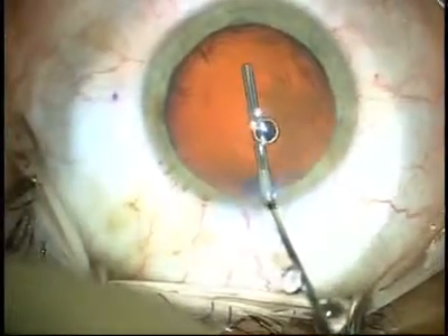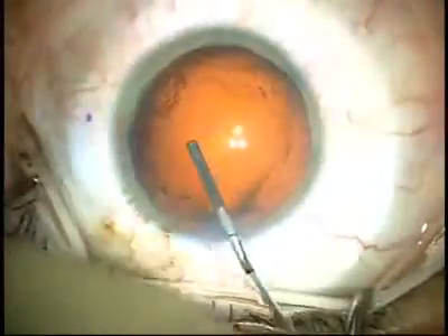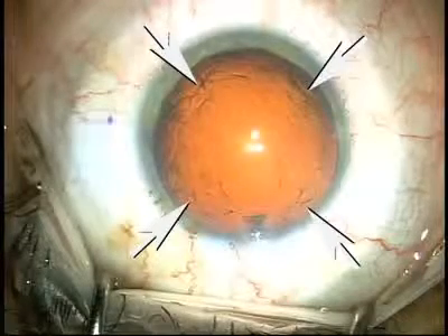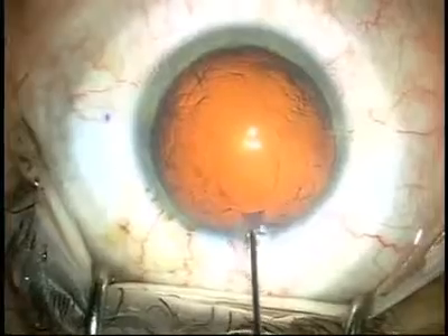What you're seeing on the screen is Helon 5 going into the eye. It tends to compress centrally and be quite smooth, but has some irregularities peripherally, as noted by the arrow.